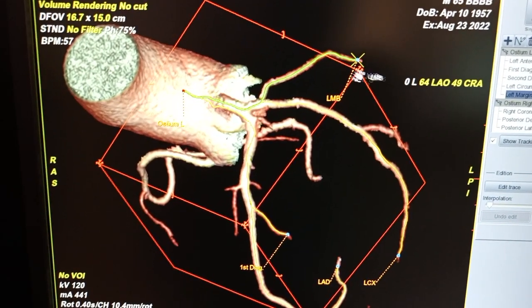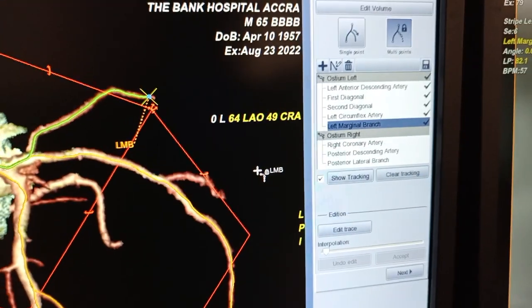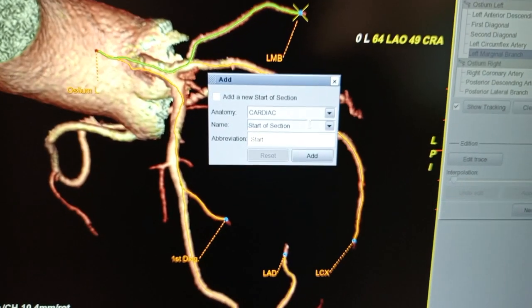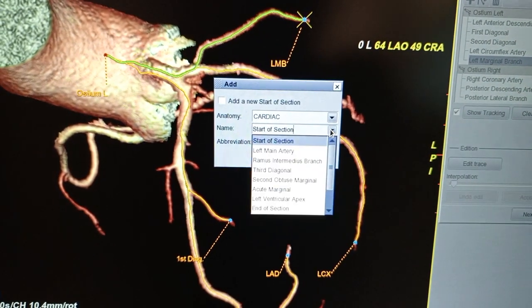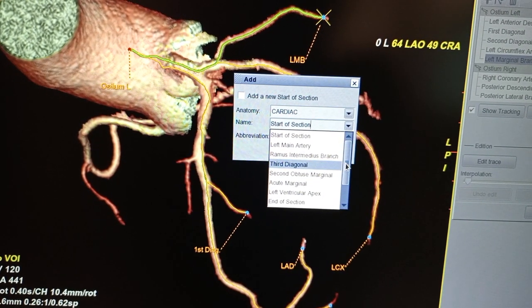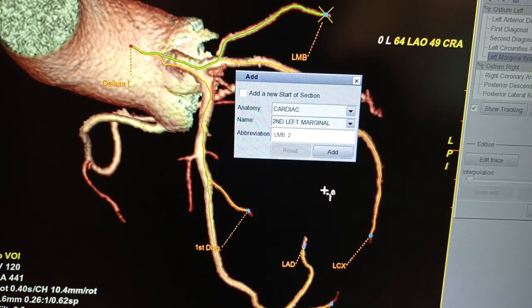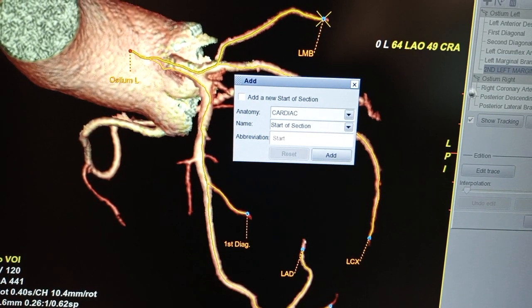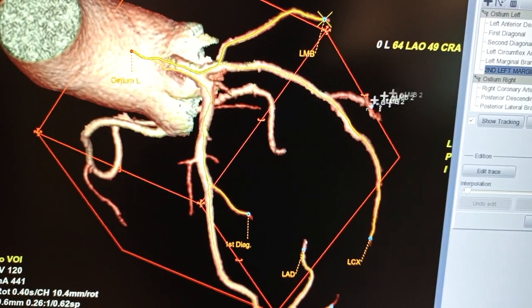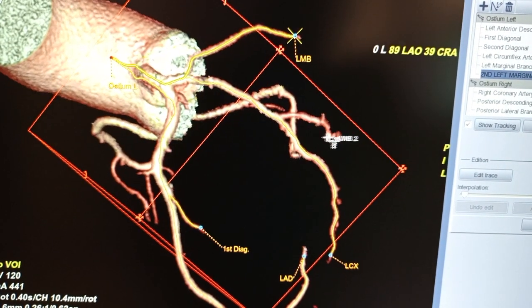This is the second marginal. Because of time, let me continue — I want to add a second marginal, so I can go through and see. This is the second marginal — I add it, it has been added, then I close it. I name this the second marginal.